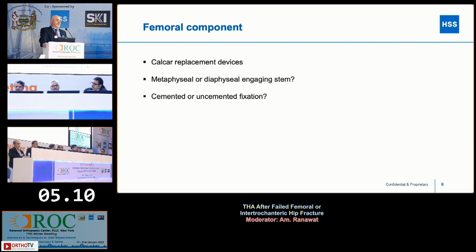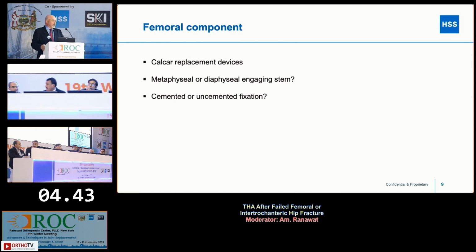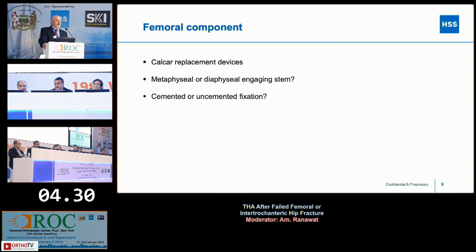We touched on it before. Like I said, I'm going to almost routinely do a non-cemented fixation. I'm going to try to do an SROM if I believe the proximal bone is supportive. Otherwise, I'll do a Wagner or a modular type stem. Who likes to cement routinely? Nobody likes to cement routinely. Not unless the patient is elderly, above 70. Above 70, you'll do it? Okay. As we mentioned, with all the screw holes and everything else, that's something to be considered. The lateral ones can be plugged, the medial ones are a little harder to plug, so I don't think it's ideal, but there are certain situations where it's a reasonable thing to do.